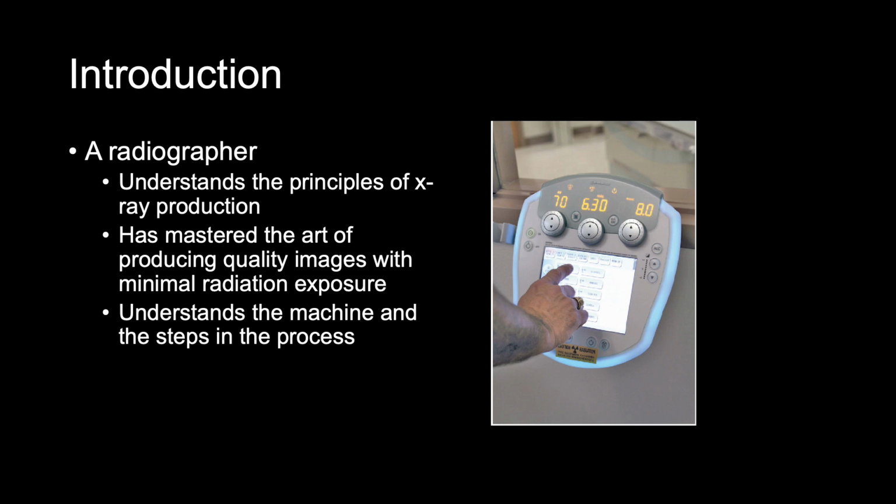We are responsible for the safety of the patient. The radiation dose that the patient receives depends on our understanding of safe operation of the X-ray machine. And then, of course, the technical factors that we put onto the control panel will result in either a poor image or a diagnostic quality image, which we're aiming for the latter. We want the diagnostic quality image.